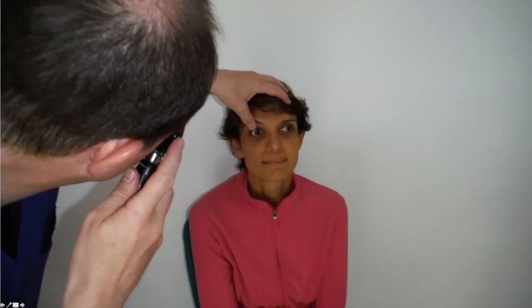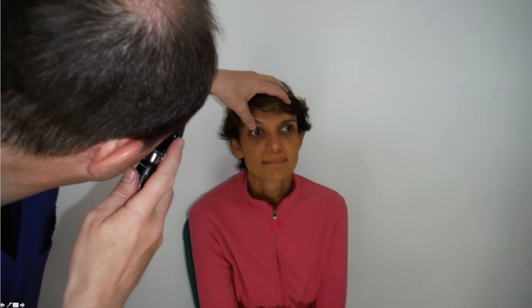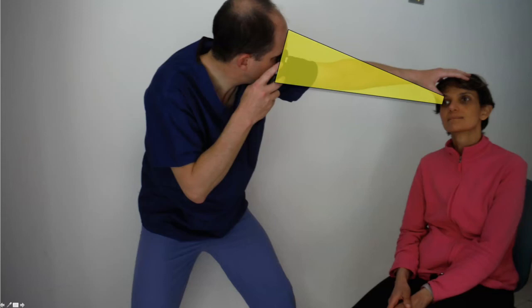When you and the patient are in the correct position, turn on your ophthalmoscope and hold it hard up against your eye. If you're examining the patient's right eye, hold the ophthalmoscope up against your right eye. You then need to envisage a cone of light going from your ophthalmoscope to the patient's eye. You should already have a red reflex, and this beam of light is your flight path down which you must move your head, using most of the muscles of your body to move towards the patient. Here is that flight path from a different angle — you can see how easy it is to veer off that flight path and lose all sight of the retina.